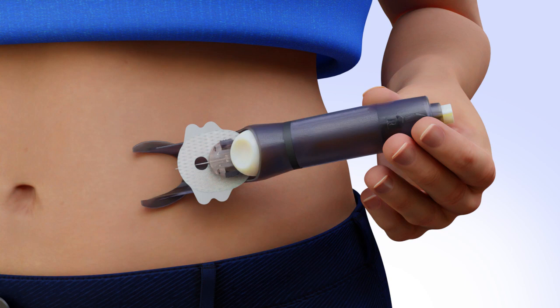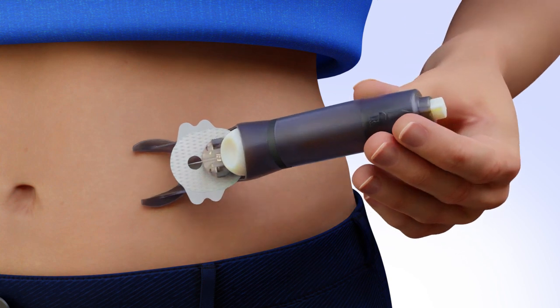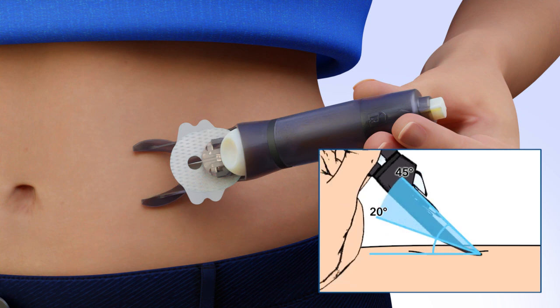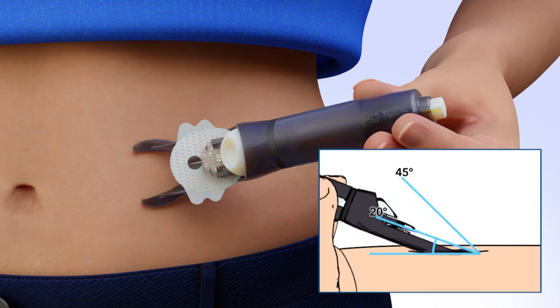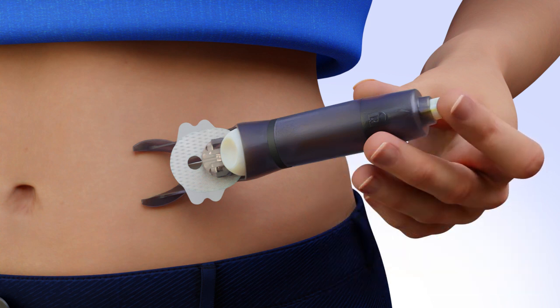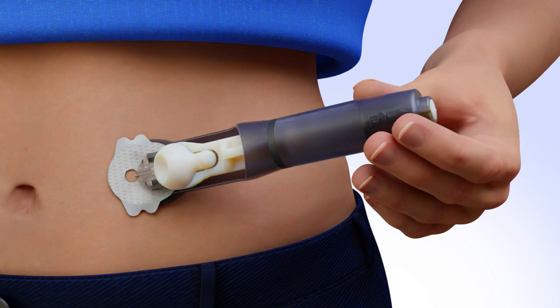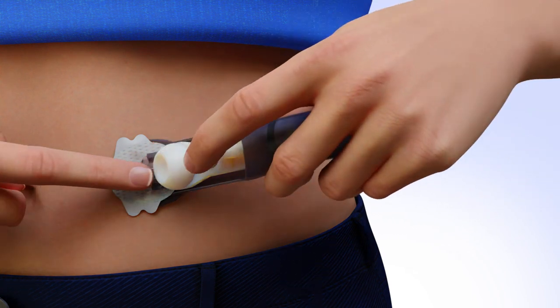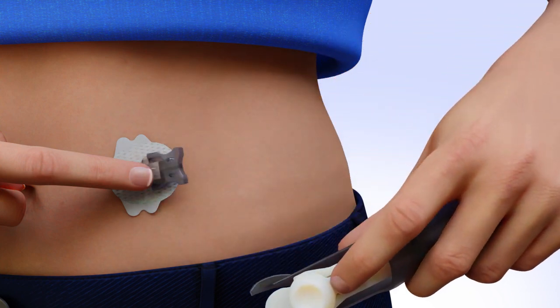To insert the infusion set, place the arms of the serter flat against the prepared infusion site. The needle should be inserted at a 20 to 45 degree angle or as instructed by your trainer. Rock the arms slightly forward to achieve a deeper angle or back to achieve a more shallow angle. Once the SilSurter is in position, firmly press the white button at the top of the serter to insert the introducer needle. To release the insertion piece from the serter, place one finger on the cannula housing. With the other hand, press the lock and release handle so the teeth are no longer locked in the insertion piece. Slide the serter back away from the introducer piece.